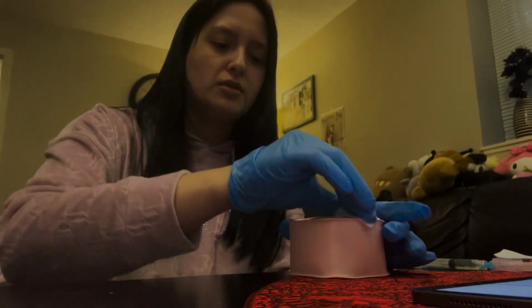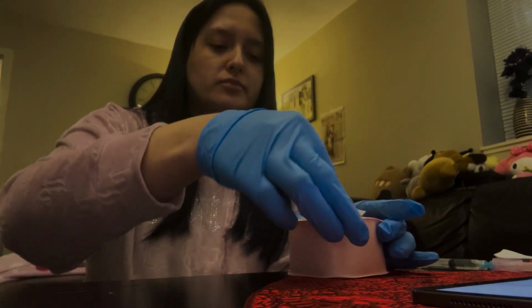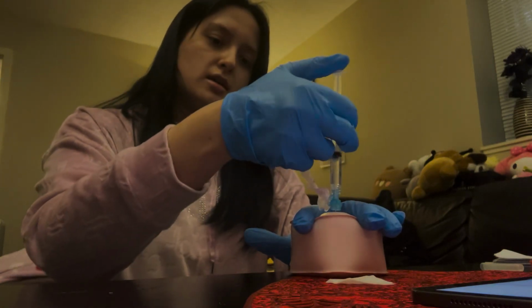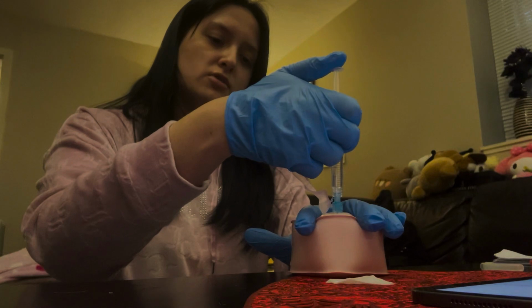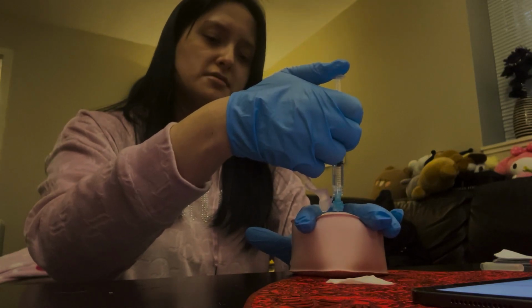I'm going to ask her to lay on her side and expose the area that I'm going to need to inject, which is going to be her ventral gluteal area. And I'm then going to just quickly sanitize the area with a little alcohol swab. And I'm going to want to place it near my site so I don't lose track of it. And then at a 90-degree angle, I'm going to inject. And then for every 1 mil, it's going to be 10 seconds. So it should be about 15 seconds.